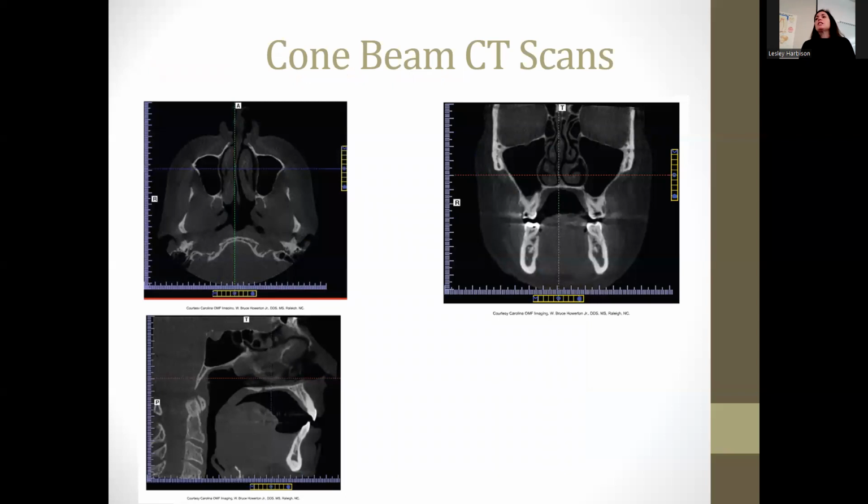So there's different ways that they can orient the image too. And so there's different planes. These are just demonstrating the different planes. So you can see there's an axial plane, which is a horizontal plane. It divides the anatomic features from superior to inferior. So sort of like layers, looking top down, right? It's like if you cut off the top of the head and look straight down, and then you can think of layers like that.